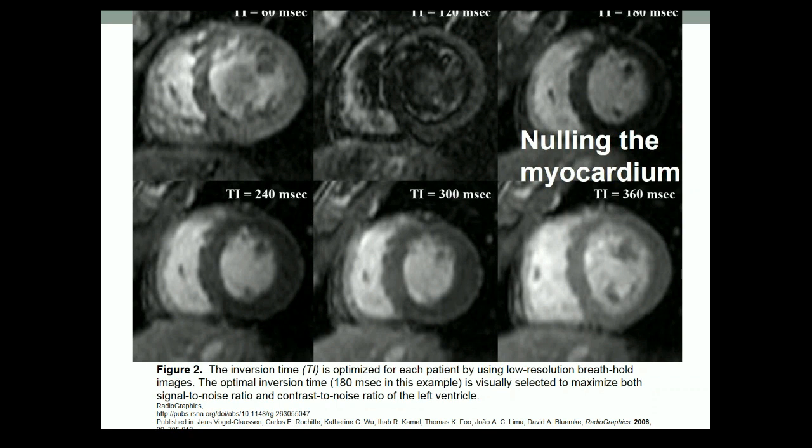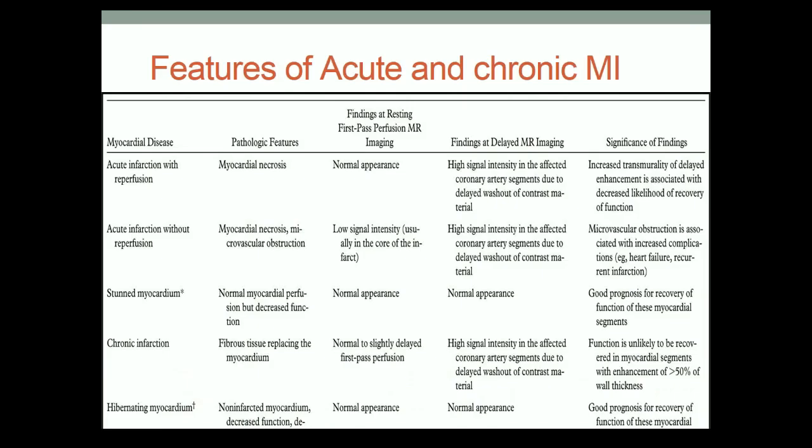The same sequence of events of repair takes place within the wall of atherosclerotic coronary arteries, which is very interesting. But we're looking at a different kind of sequence. We're looking for the myocarditis sequence, which is not accompanied by fatty replacement. We're looking for the sarcoid sequence, where there is replacement of myocardium by sarcoid or by amyloid, but we don't see the process of going from fatty to fibrofatty to fibrous to calcification.